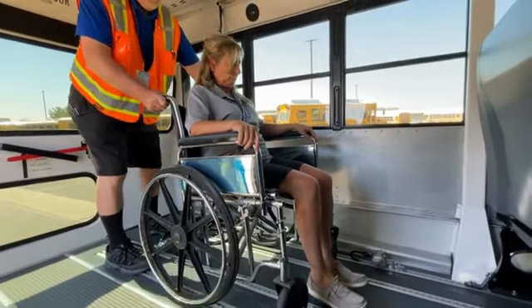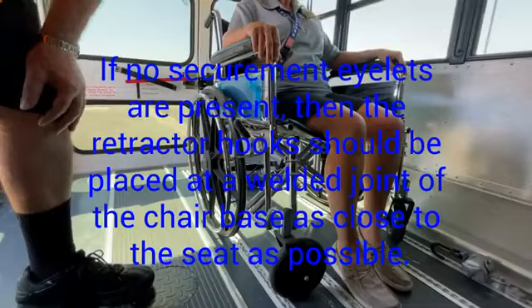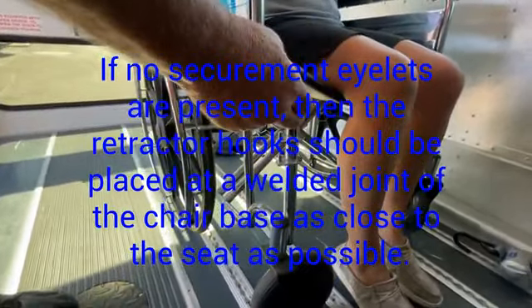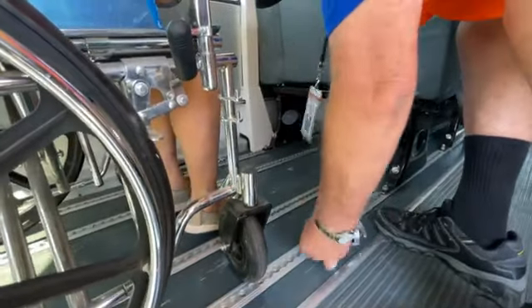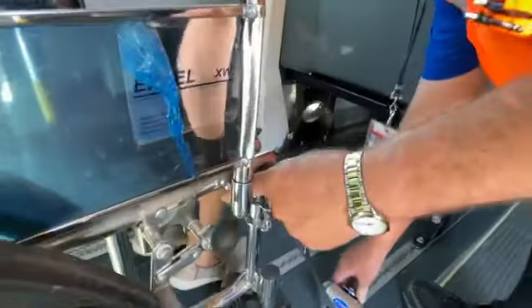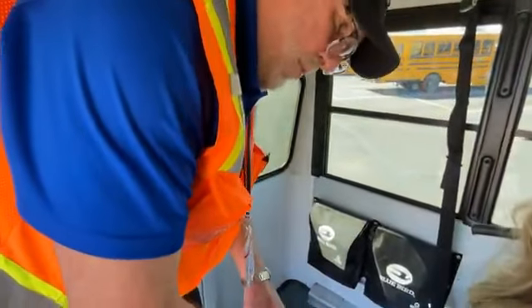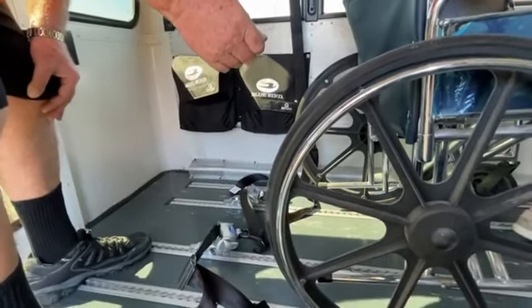When you have a position that you think is right, go ahead and lock your brakes. In a wheelchair that does not have securement eyelets like this one, you need to put the retraction hook on the part of the frame that's near a weld, as close to the seat bottom as possible. When you place the front anchors, the retraction hook must face inward on the frame. When you place the retraction hooks on the rear, again you want it near a welded spot and as close to the seat bottom as possible. The retraction hooks on the rear face outward.